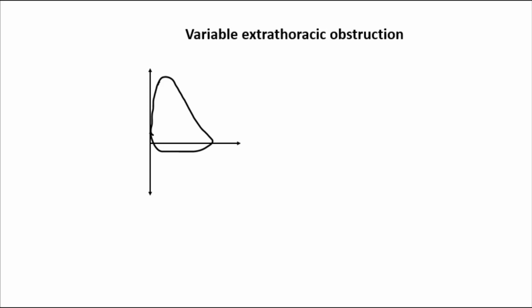Next, we'll discuss variable extrathoracic obstruction. Variable extrathoracic obstruction is also known as dynamic or non-fixed extrathoracic obstruction.